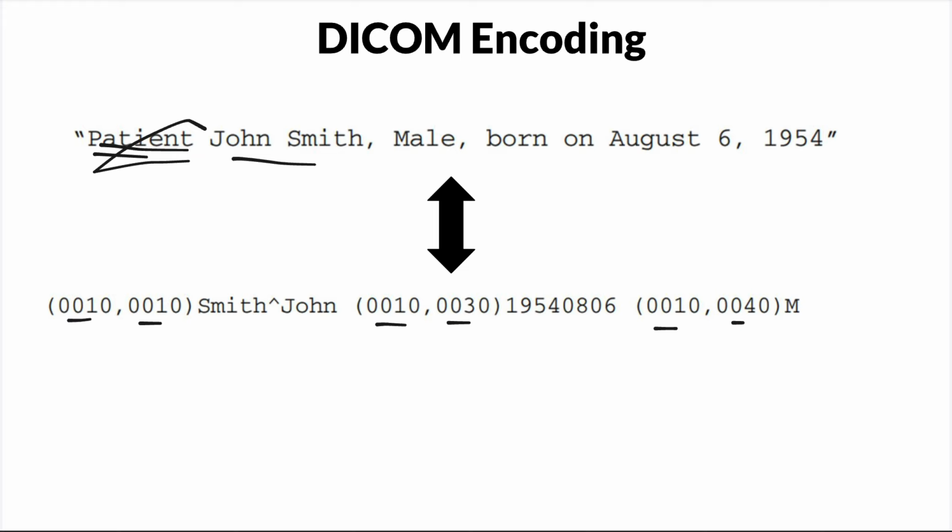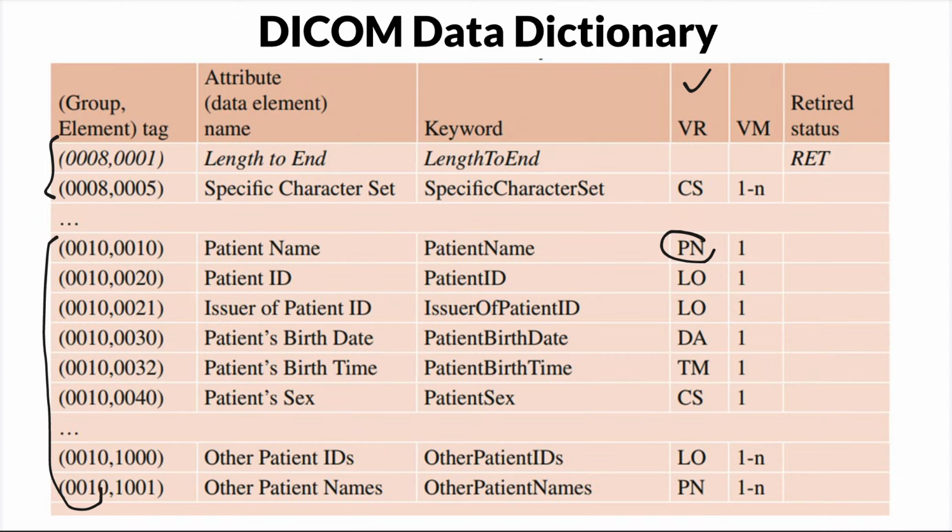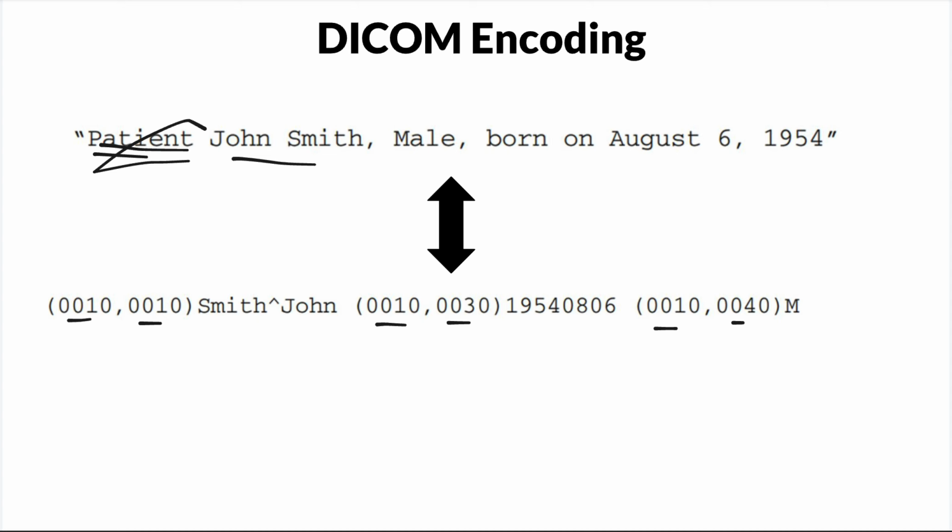So let's then go and find out. If you look at the gender, the date is 0030 and the sex is 0040. Let's go and see whether it's like that. Okay, yeah, 0030 is for the date, 0040 is for the gender. Obviously, so now we define our tag.